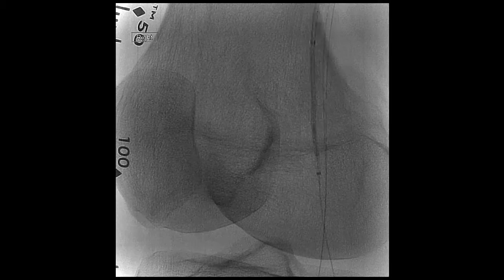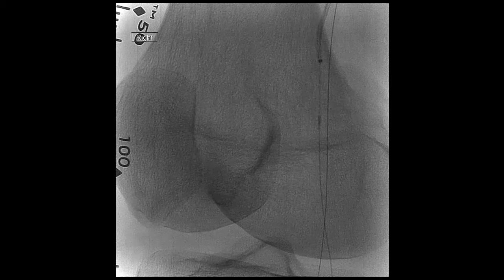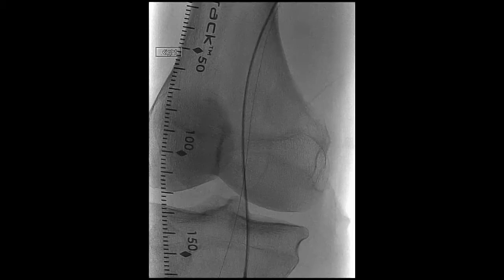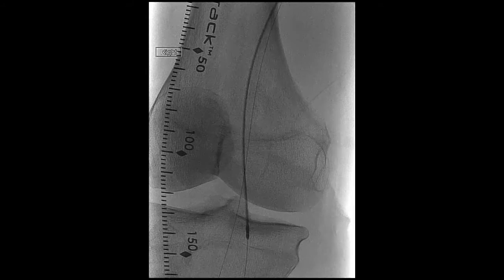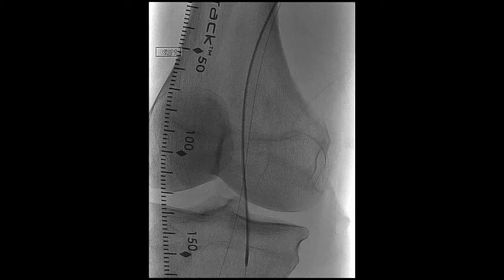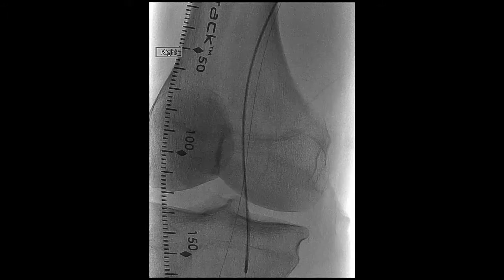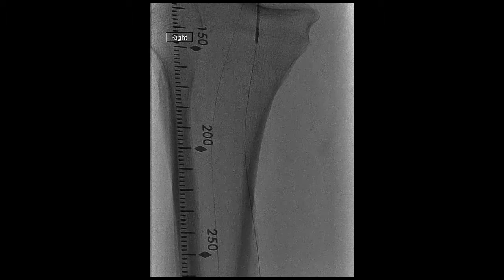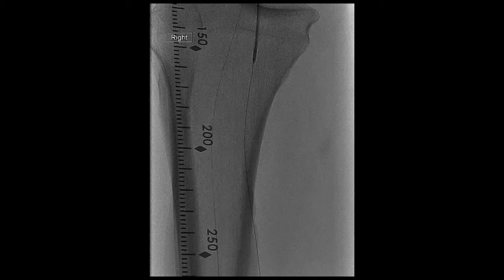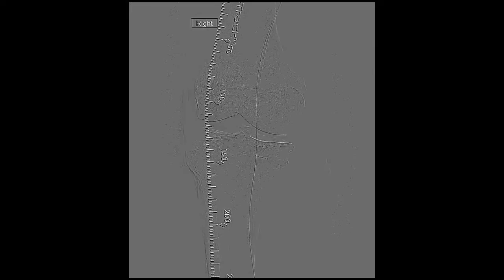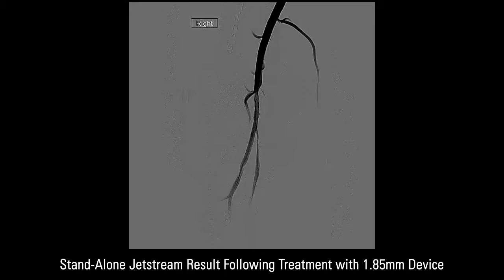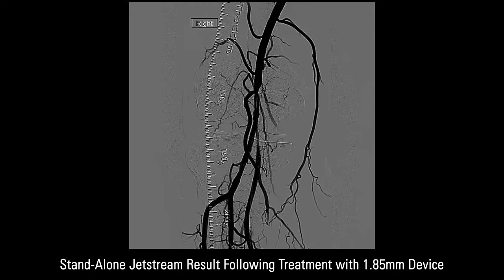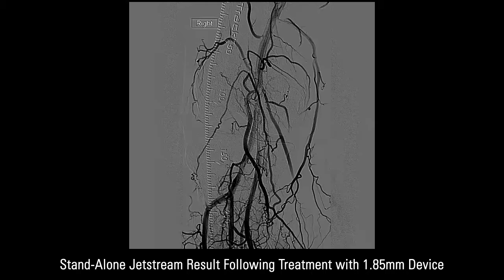What you see here is a 7 mm snare where we snared our 0.014 wire in a retrograde fashion and advanced the 0.035 NaviCross catheter to the posterior tibial artery. We have a wire secured in the peroneal artery, and a wire that's flossed and secured in the posterior tibial artery. We proceeded with using the 1.85 mm device from the popliteal artery into the posterior tibial artery, thus securing the bifurcation between the posterior tibial artery and the TPT trunk. After performing aspirational atherectomy, we can clearly see the posterior tibial artery filling via antegrade fashion.